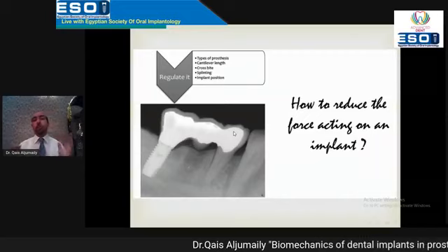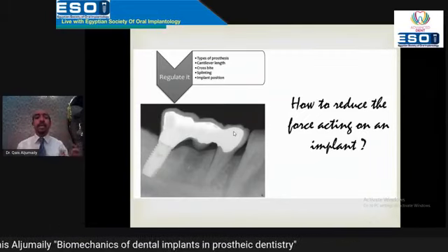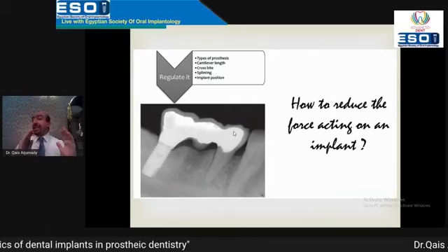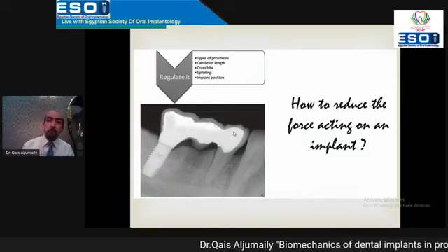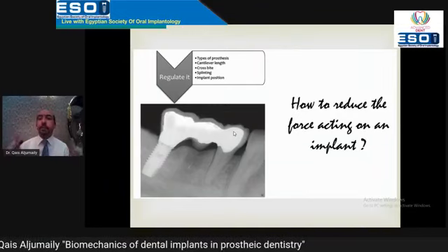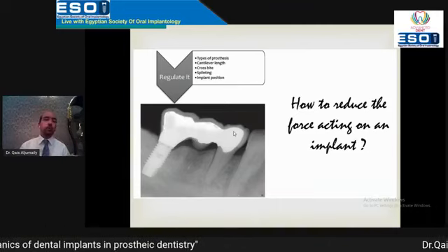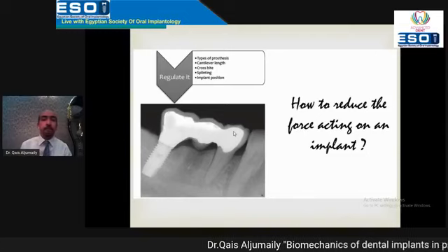So try always to avoid connecting between a natural tooth and a dental implant when there is a termination, terminal abutment implant here and terminal abutment natural tooth here. If the terminals are the same type, sometimes there is some permission to connect between them, but the general principle is not to connect.